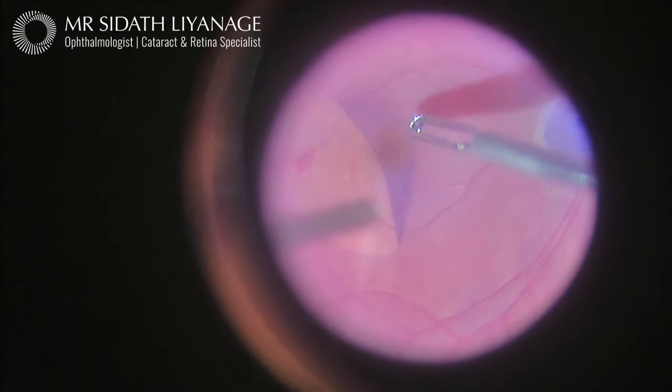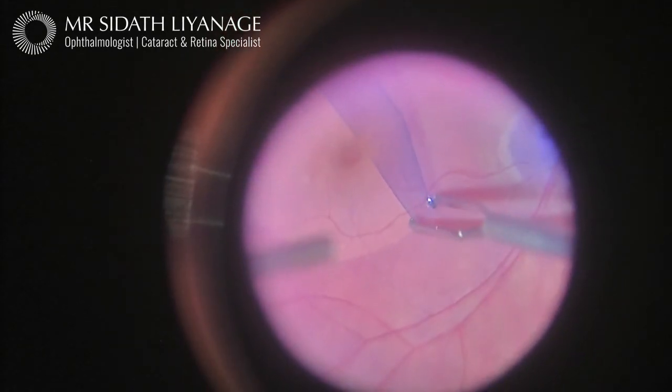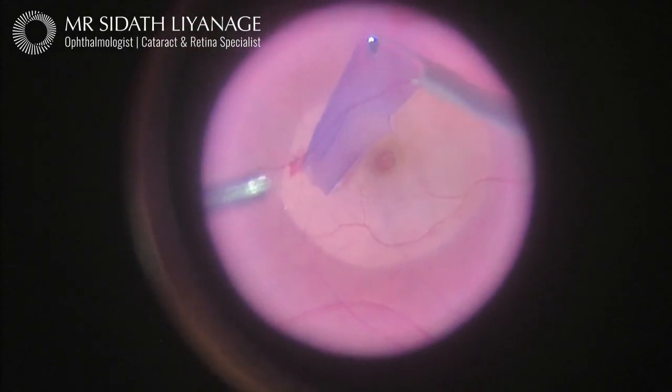This is a very magnified view. To give some perspective of the distances involved, this macular hole measures approximately half a millimetre. The membrane is a few thousandths of a millimetre thick, and I am keeping my forceps less than a millimetre above the retina.